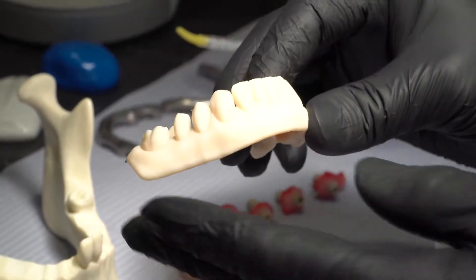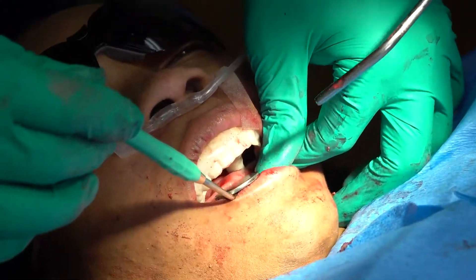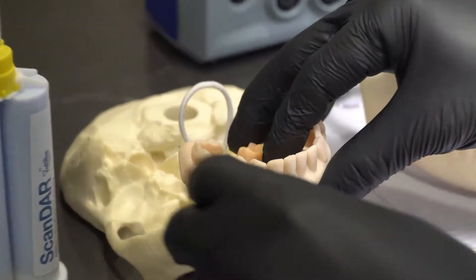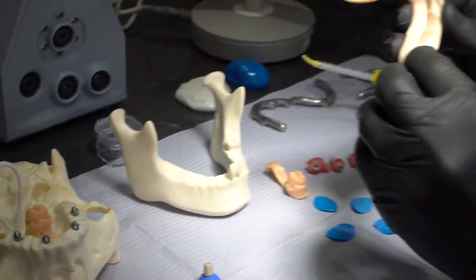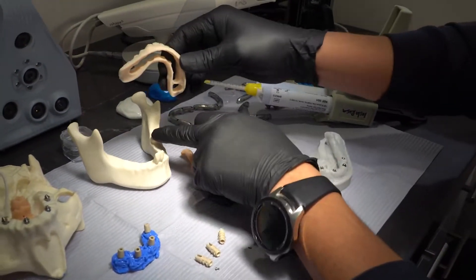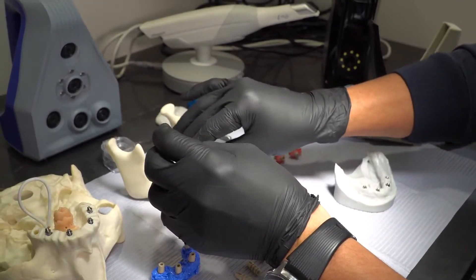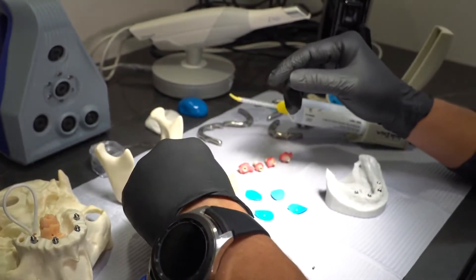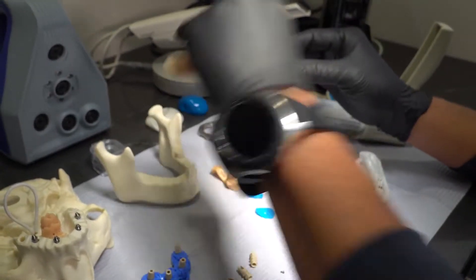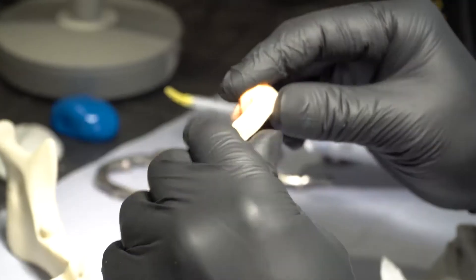Here we have one of our window templates to help doctors reduce bone and also to see the angulation of the multi-units when placing them in the mouth. We also see that on top of the tooth, so it can guide us to stabilize the window template. We don't use pins or anything like that — we basically take it out and put it back.